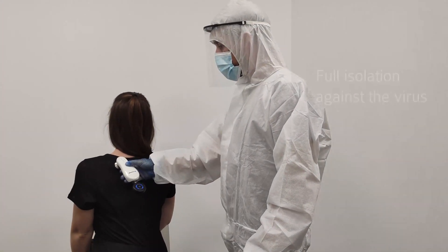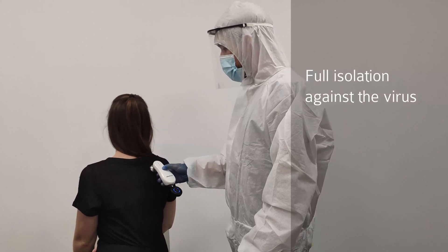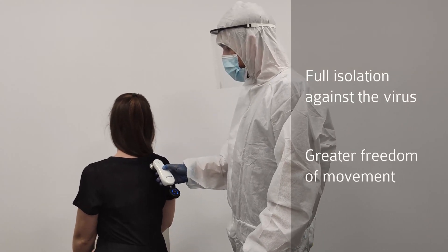Besides that, the patient will be safer and you will be able to perform the auscultation effectively.